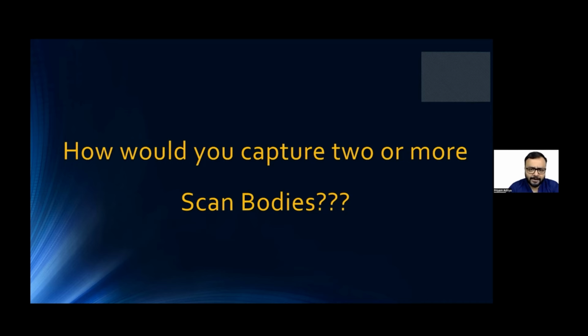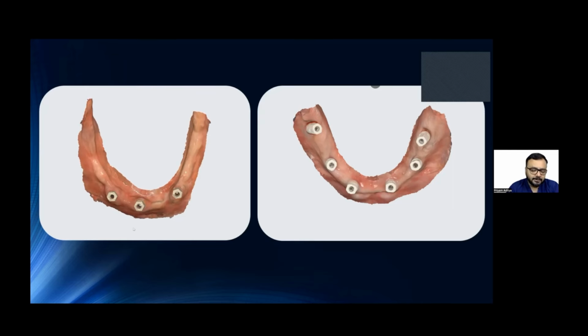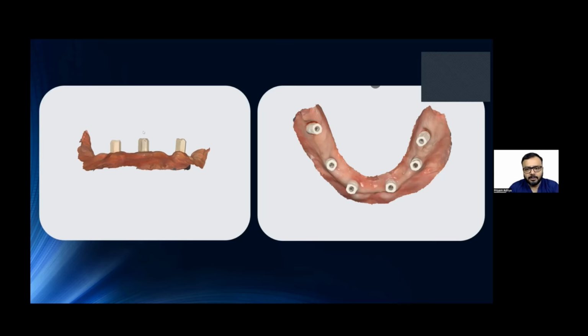And if you follow the right techniques, you will be very easily able to do not just single or double implants, you'll be able to do full arches also. I'm particularly showing you mandibular arch scans here because they are notorious for getting distorted with intraoral scanners. But if you follow the right techniques, it is possible for you to record them without distortion. And these are completed cases. We have done verifications. Scanning was not a problem at all in these cases. And of course, you can record both maxilla and mandible also.